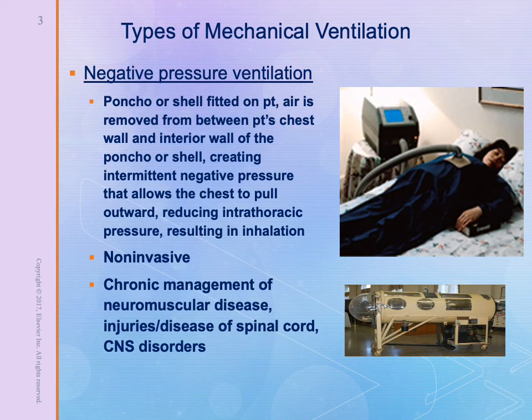There are two types of mechanical ventilation. There is negative pressure ventilation and positive pressure ventilation. Negative pressure ventilation is a non-invasive form of mechanical ventilation.